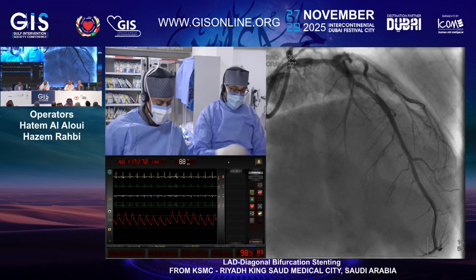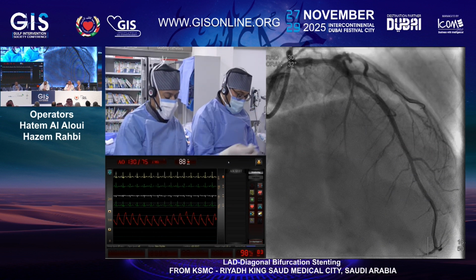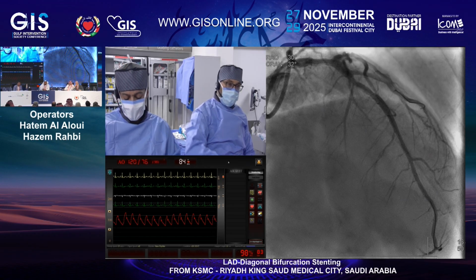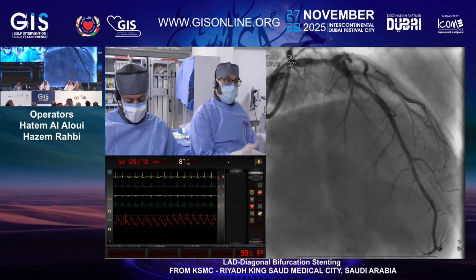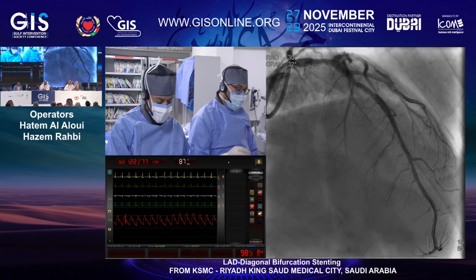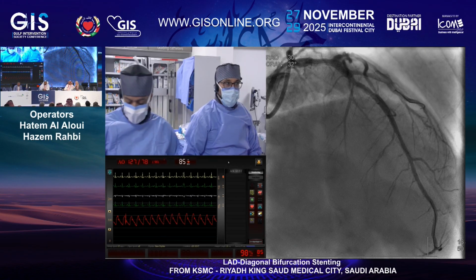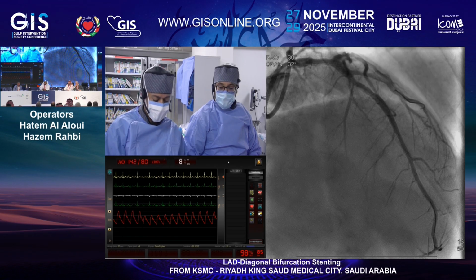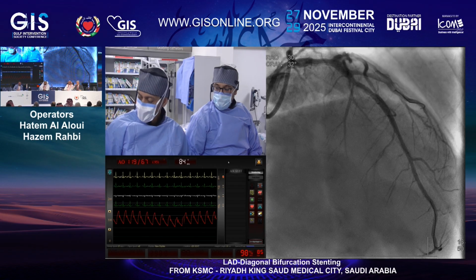You would go with 3.0 or 3.5? 3.5. We'll go with the 3.5. 3.5 by 28. And as I said, it's very important to choose the appropriate stent length, to get a good distance for a good POT proximally. The 3.5 stent size as well is important.